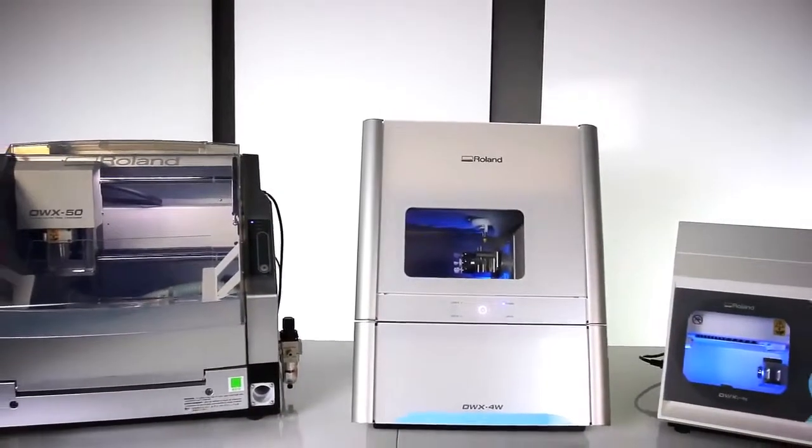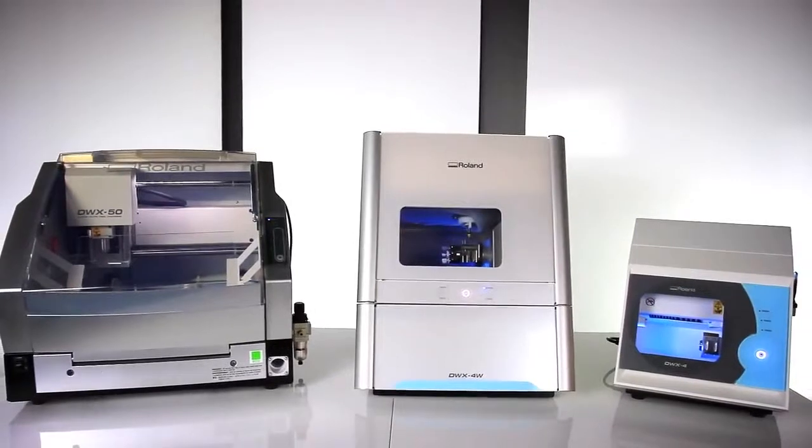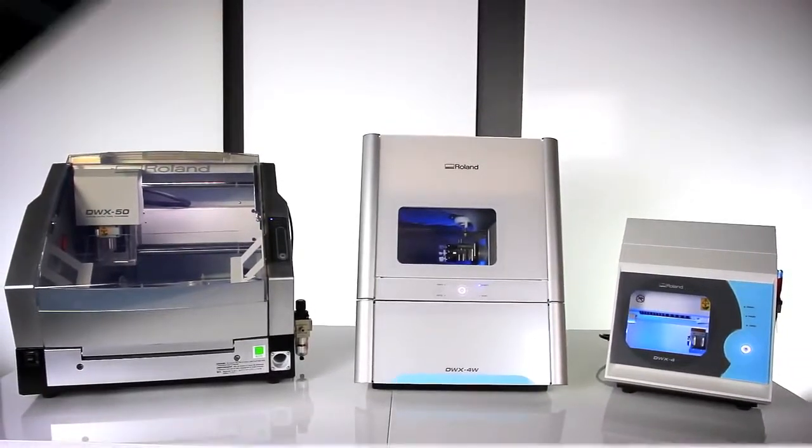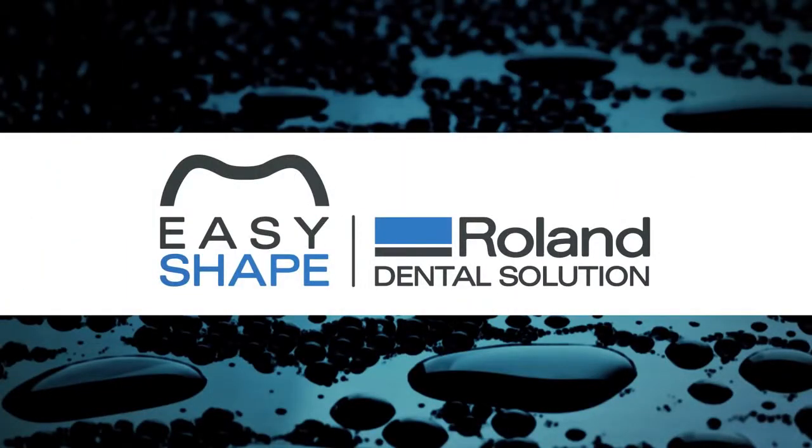The DWX-4W wet dental mill, the latest in dental milling performance from Roland.